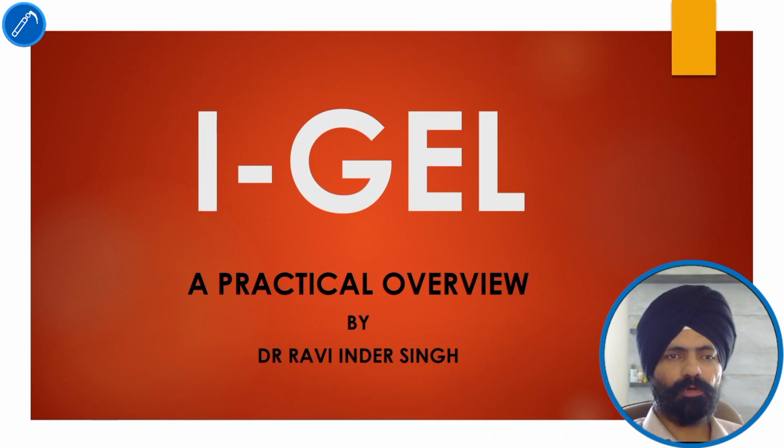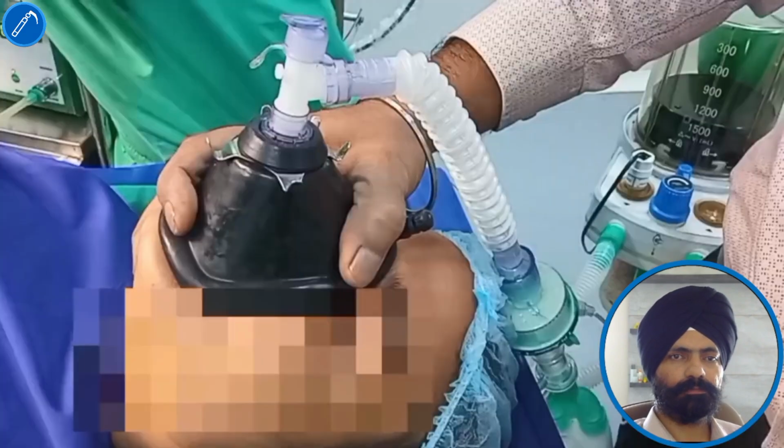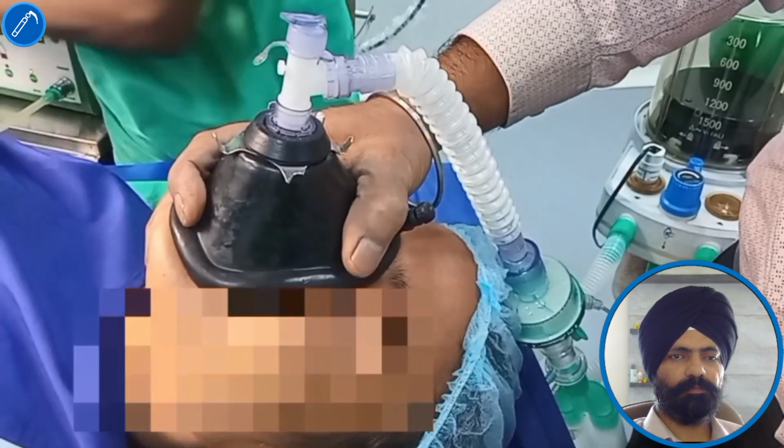Today I am going to talk about the iGel, its use and its technique of insertion. First of all, I will show you a video of the iGel insertion technique. Then I will talk about it later. So this is a video.